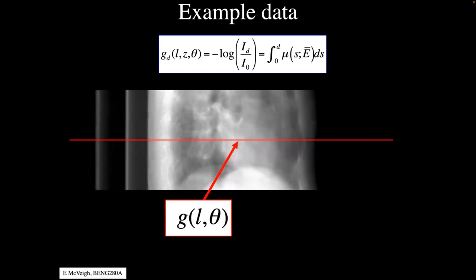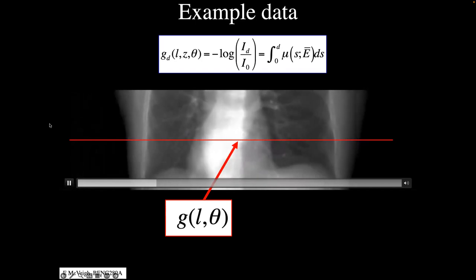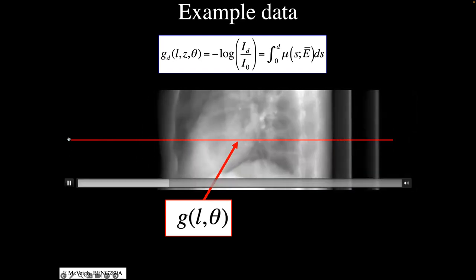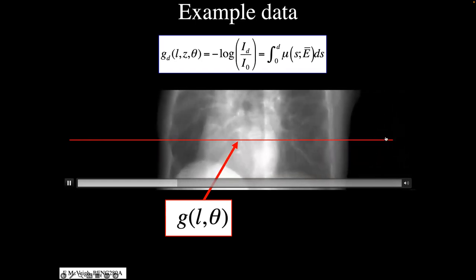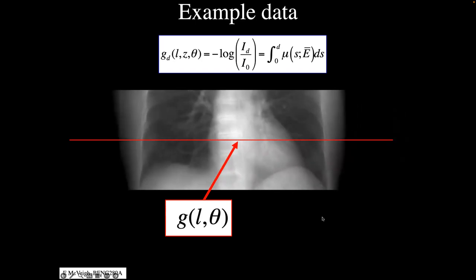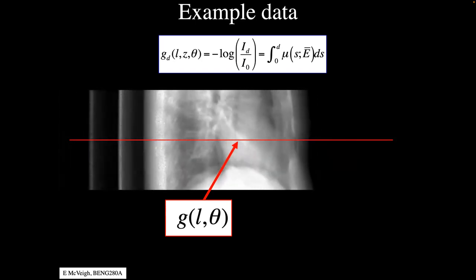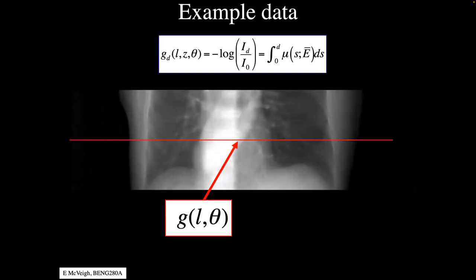They're not straight along. So for math's sake, because it gets really complicated, really horrible to deal with all of these fan beams in multiple directions, we're going to look at the math in this one plane, right, where the x-rays are coming straight down through the patient. So the image that we'll look at will have two spatial variables, X and Y, and it'll be an axial plane through the scanner, okay?